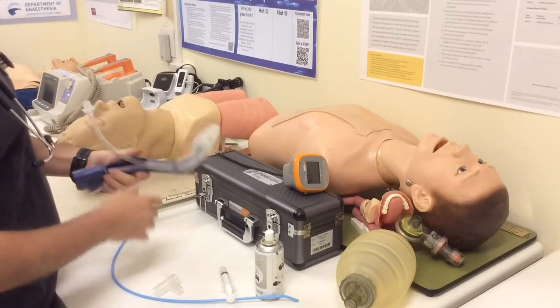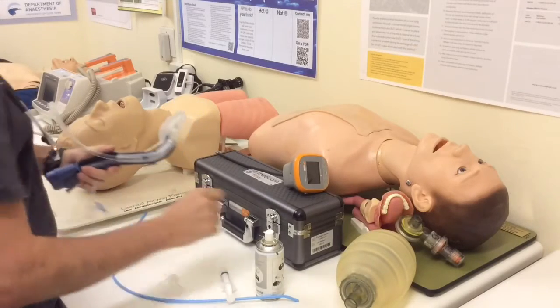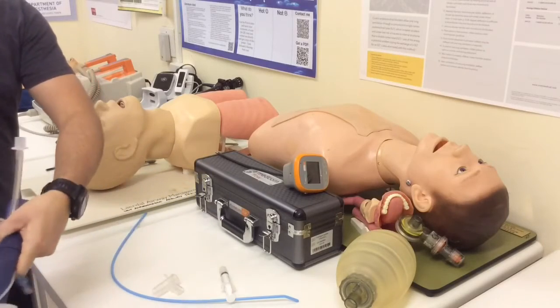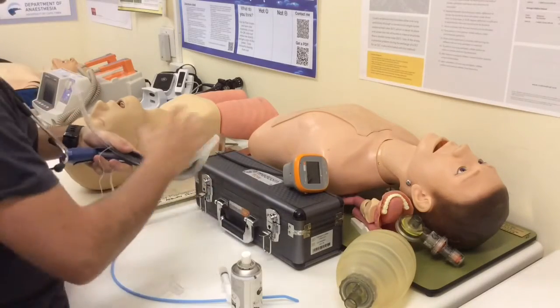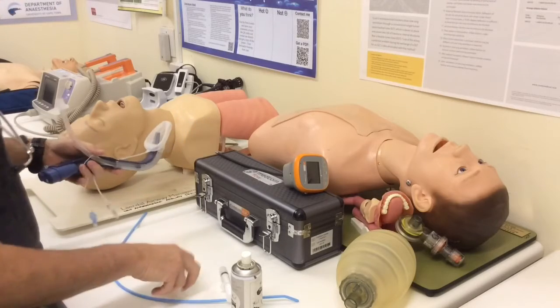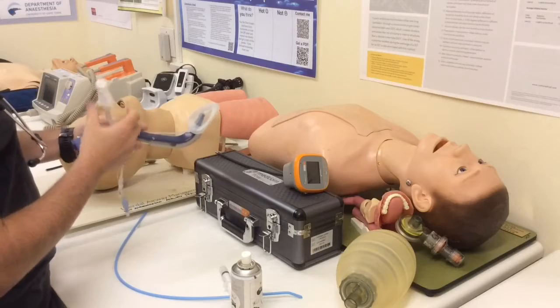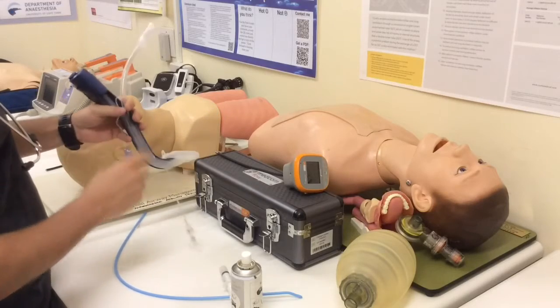Other things for preparation, well obviously I'm going to make sure this cuff is mostly deflated. I'm going to lubricate the back of the device like I normally would, and a little bit on the sides, taking care not to get any in the bowl over there. And then I like to pre-place this elbow connector on the ET tube. The reason for that will become apparent just now. Right, so now we're nearly good to go.